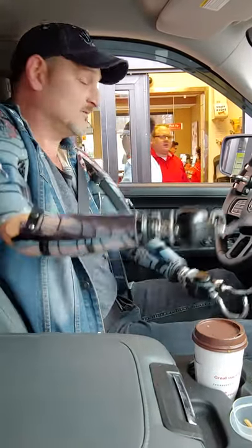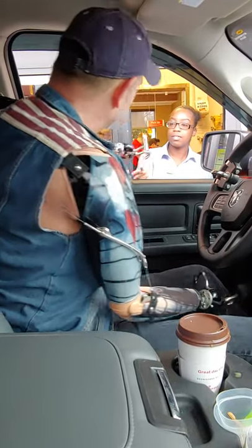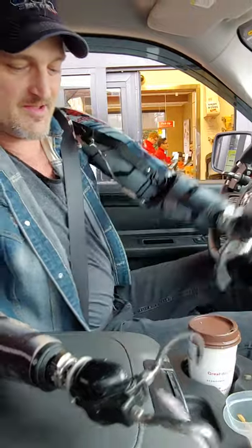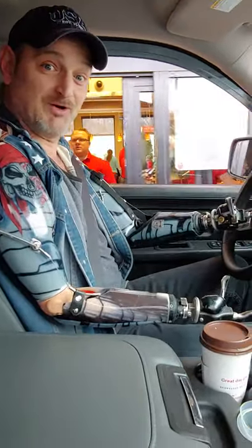It happens sometimes. Excuse me a second — can I get a straw? There you go! Thank you! Alright ladies and gentlemen, that's how you get coffee with these prosthetics.